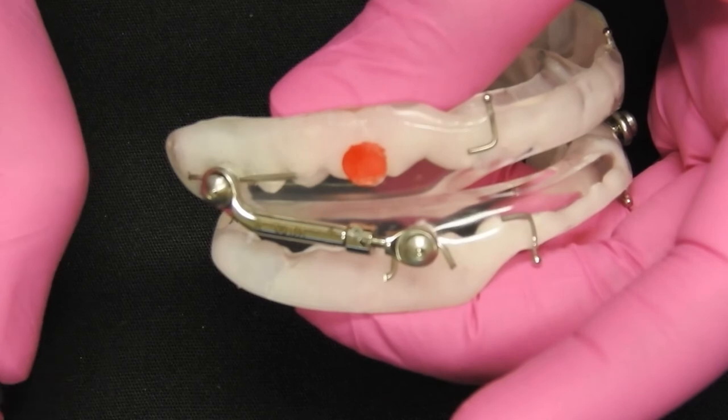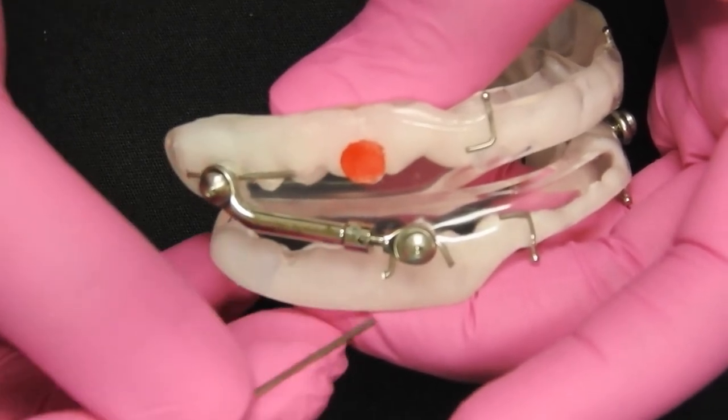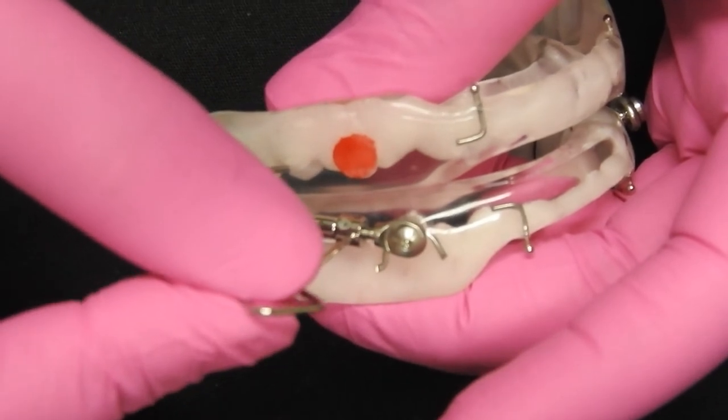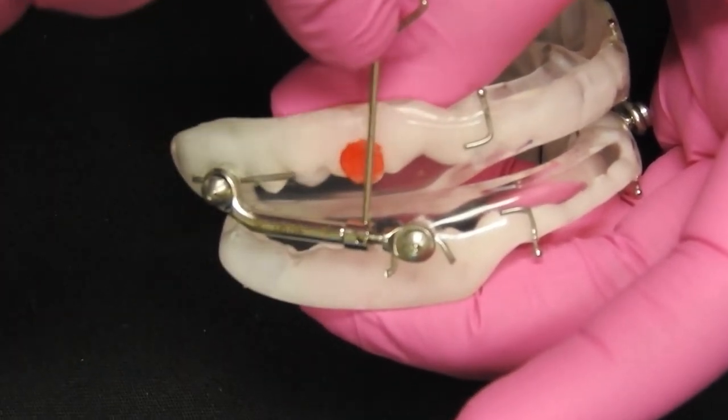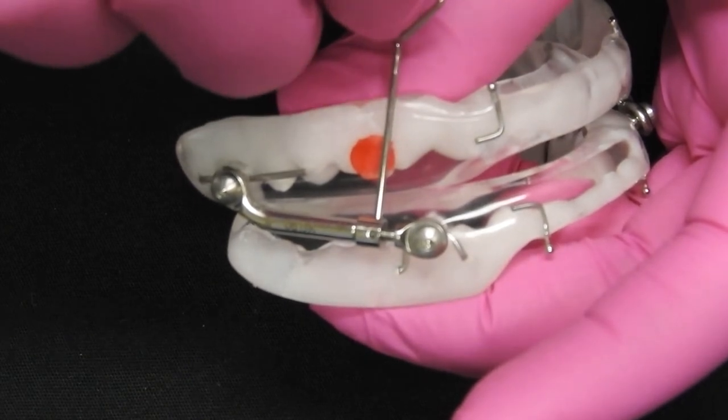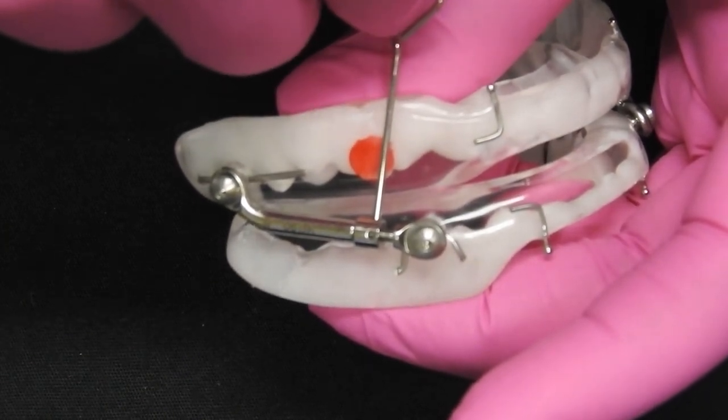Then take the key and insert it again into the middle titration hole for two turns. You will do the turns according to the schedule the doctor has given you.